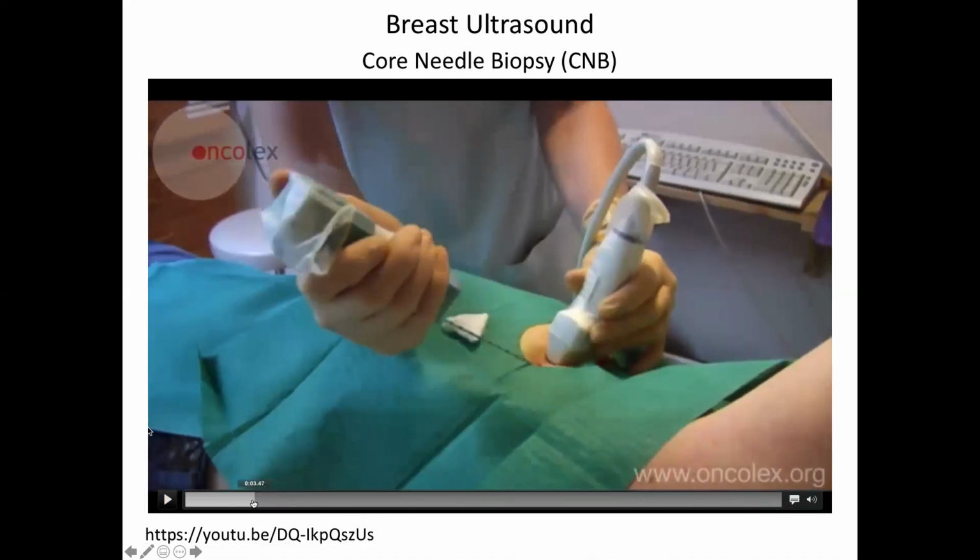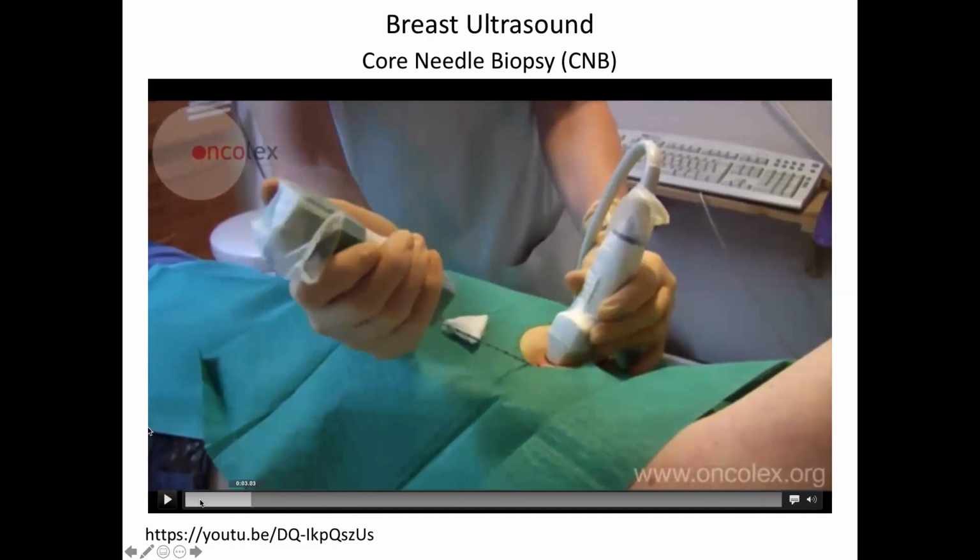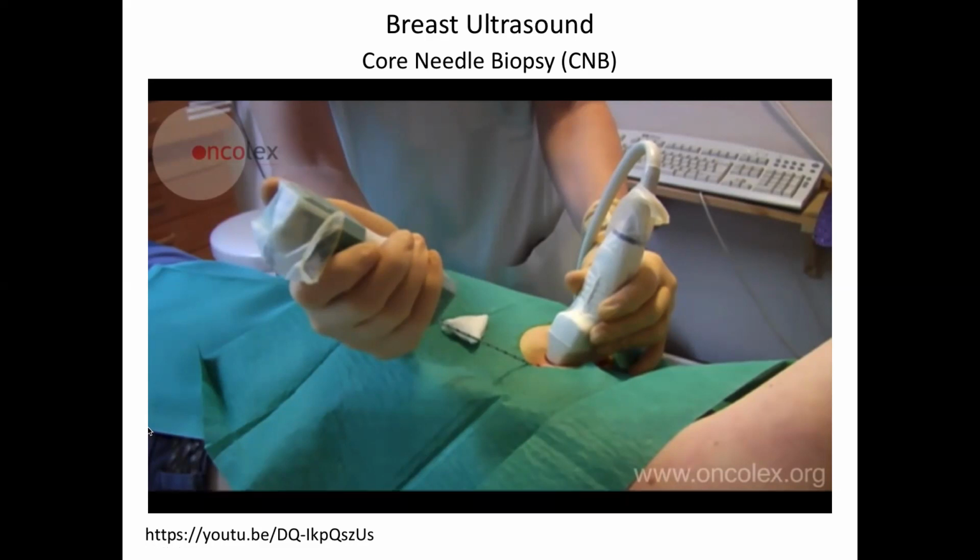Wait a minute, right? So this doesn't look like the one we just looked at. It has its trigger, looks like a thumb trigger here. You have your transducer here along. You want obviously the shaft of the cannula to be aligned with the plane of the ultrasound, right? It's going to come in and out of plane pretty easily.